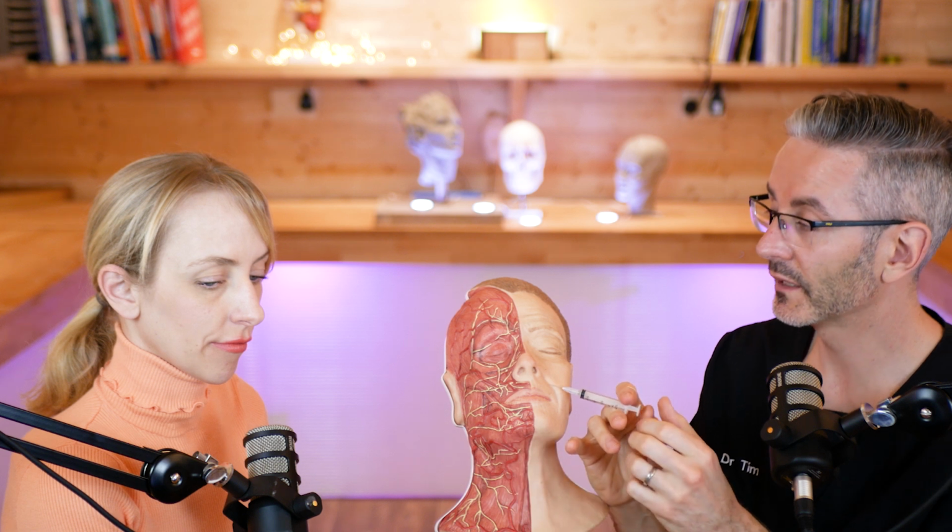As soon as you move a little bit, there's no point aspirating. You're not checking the spot where you're injecting. You're checking a nearby area. And when it comes to arteries, you have to be precise or there's no point. So that's the first thing: you need to have a stable patient, stable hand. It's all back down to that stability.